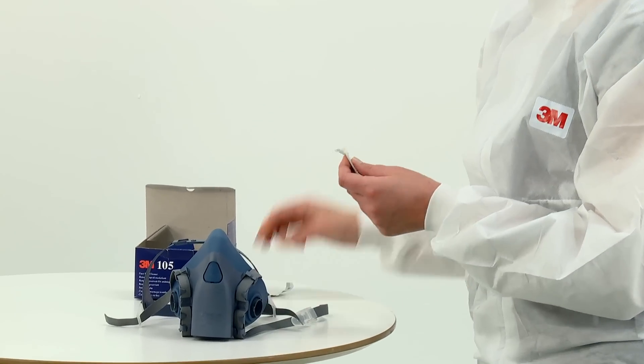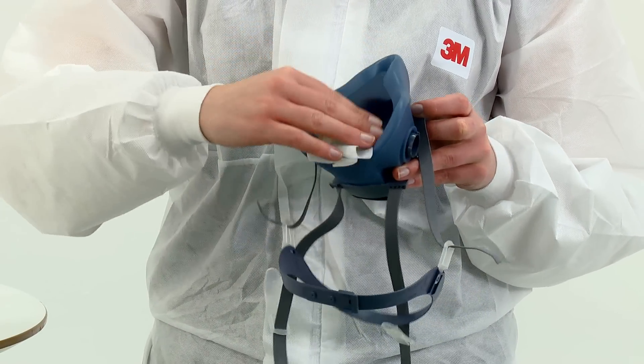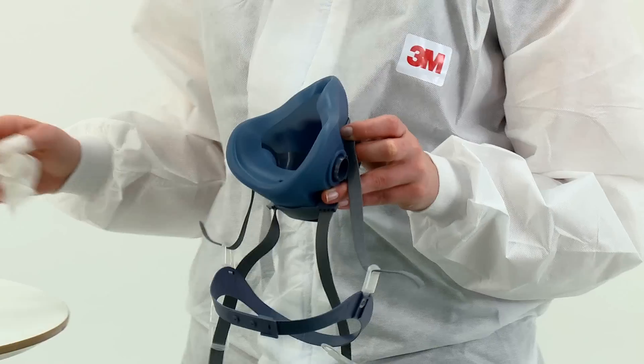The respirator should be cleaned at the end of each shift, dried at room temperature, and stored in the sealed container or bag.